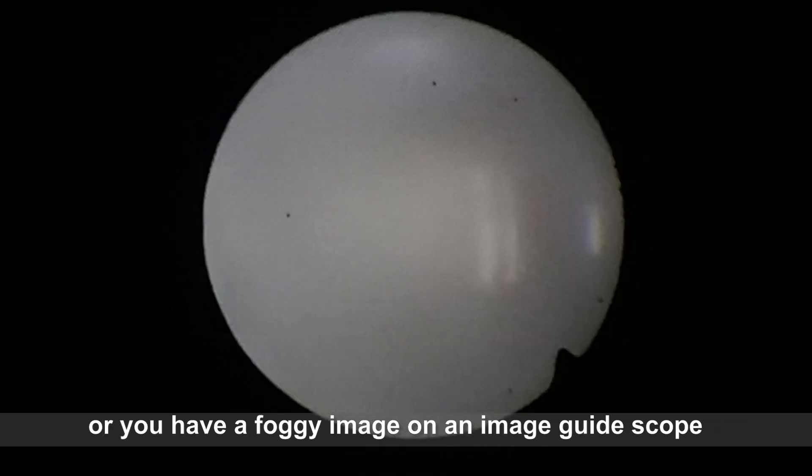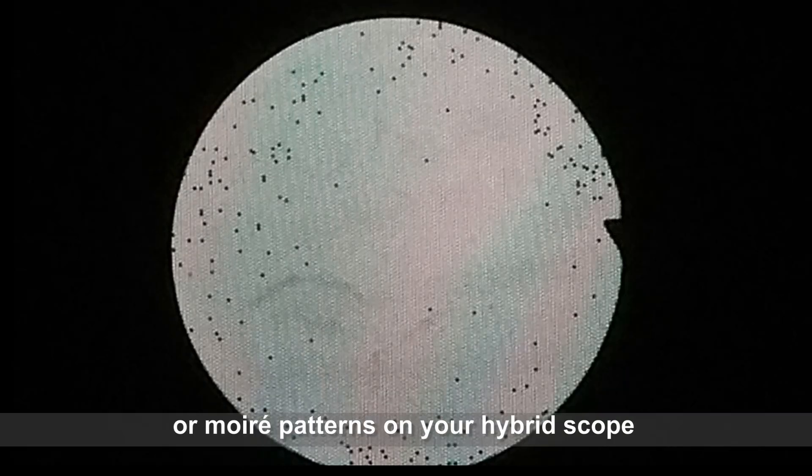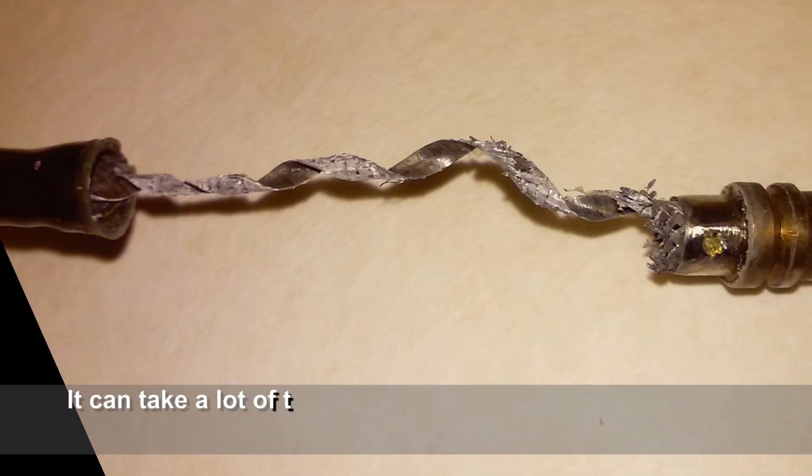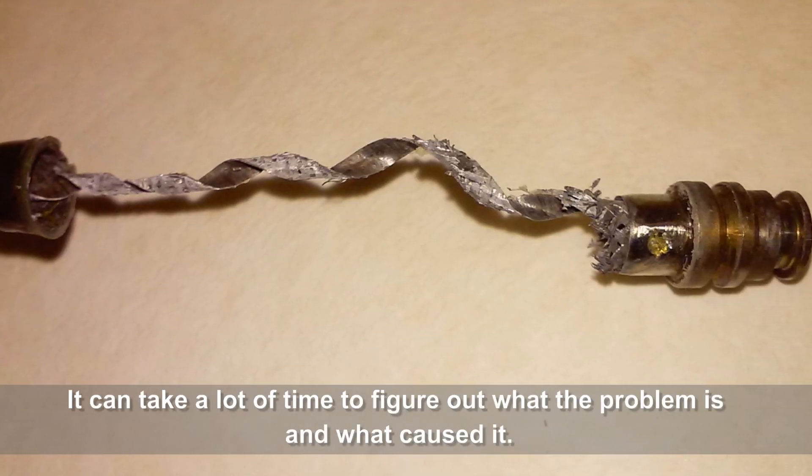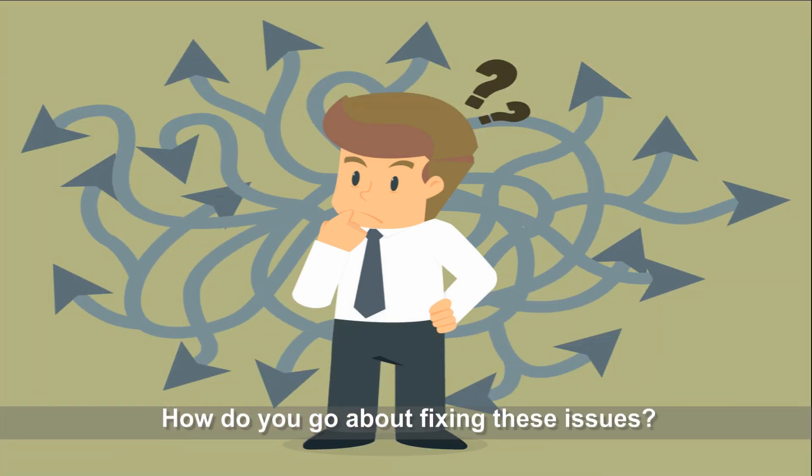Or you may have a foggy image on an image guide scope, or moiré patterns on your hybrid scope, or a blackout problem on your H190 scopes, and so on. It can take a lot of time to figure out what the problem is and what caused it, and how to go about fixing these issues.